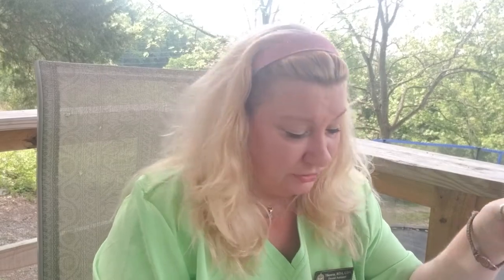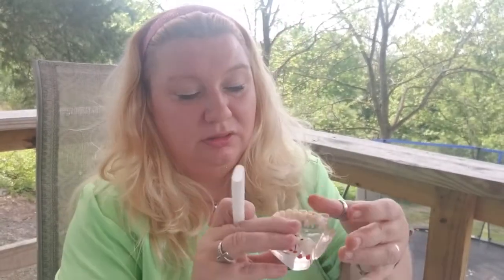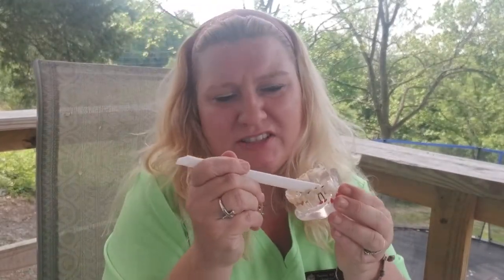Once you've done the etch for 30 seconds to a minute, you can ask, 'Are you ready for me to rinse?' After 30 seconds they'll say no, a little longer. Then you would take your suction tip and hold it right on top where the etch is. Suck up as much of the etch as you possibly can off the tooth before rinsing. Otherwise you can push the etch off into the throat and it tastes like really bad lemons, and it could turn their tissue white for up to 72 hours. Spray some water in the mouth if needed and have them close down so the suction can pick it all up.